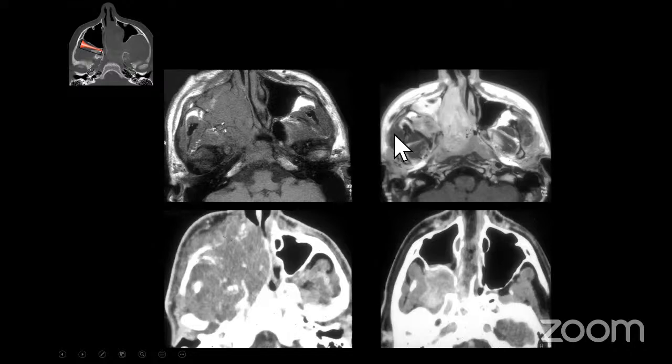But the point is that if you have an adolescent male that comes in, and you say that they had epistaxis, you're always going to jump on the diagnosis of juvenile angiofibroma without even looking at the imaging. But realize that this disease entity that can also arise in adolescent males can also present with nasal stuffiness and epistaxis. So one of these is juvenile angiofibroma, and then one of these is a rhabdomyosarcoma.